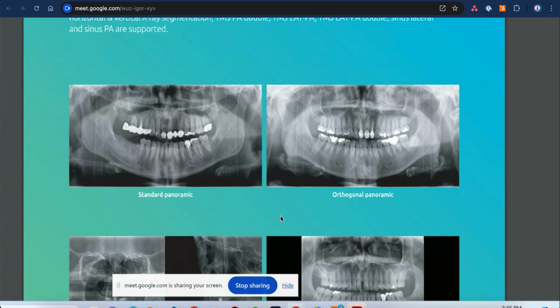Also, we have the handy switch. I have two options: either I can press it beside the patient, or outside the room, which is of course better, because as a dentist or radiologist, I'm doing x-ray exposure regularly. So I am more prone to the changes that the patient may experience with the high dose, so I must keep it as safe as possible.